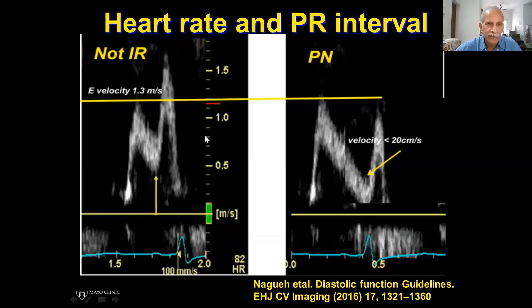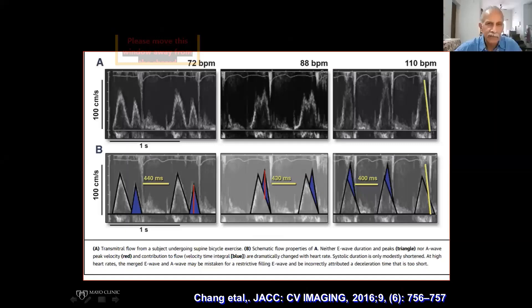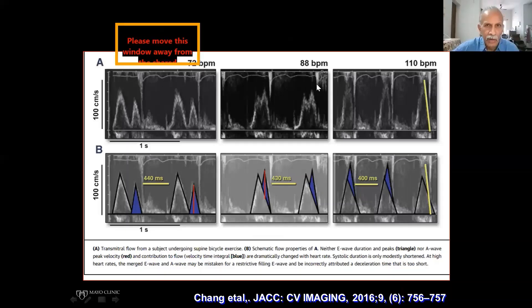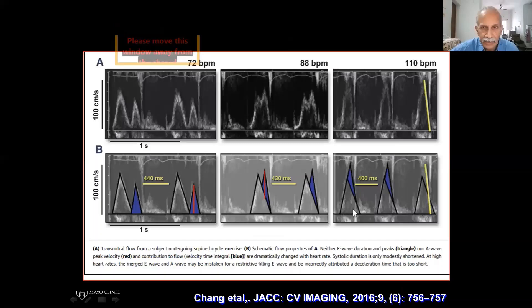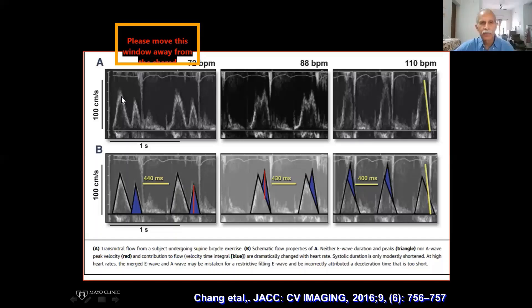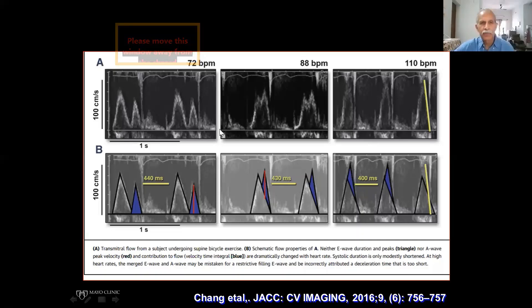This clearly shows the importance. This is one of the older studies which Dr. Chang was known for. When heart rate increases from 72 to 88, A comes in earlier, they merge together. When heart rate is 110, they merge much more quickly. The reality is when E and A merge, the atrial contribution doesn't contribute anything to LV at all — in fact, it is losing the atrial contribution. This clearly points out that in patients who are short of breath or have high heart rate, even though it may appear like normal diastology, pay attention to E/A ratio and A-wave. These are people who might benefit from a beta blocker to slow the heart rate.